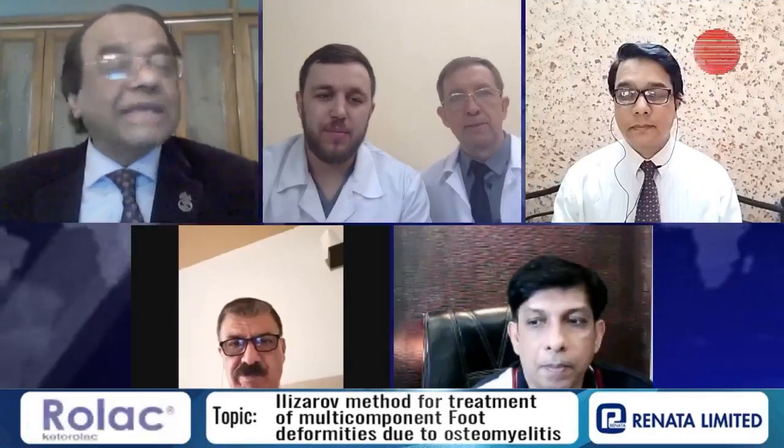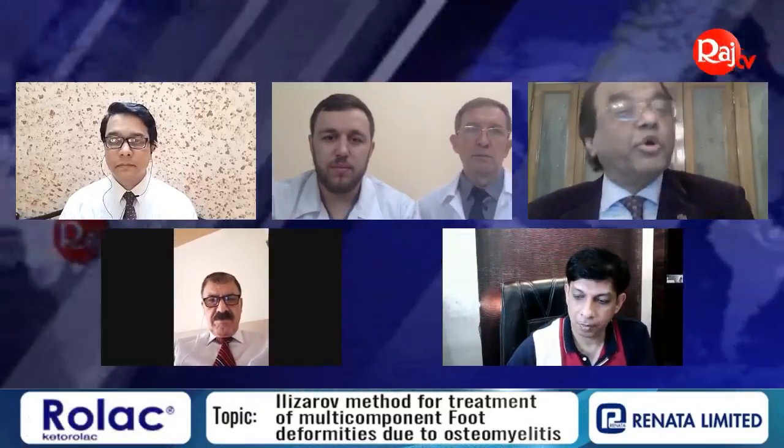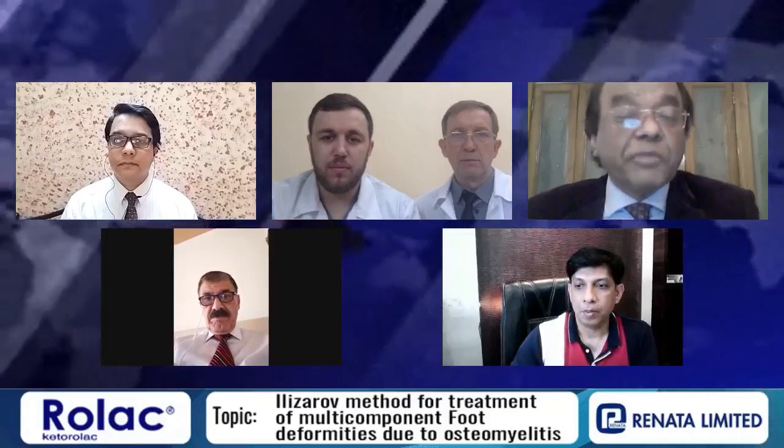Anatoly, I must say, these are fantastic cases that you have shown. Unique, excellent, because at this time I'm working on the same cases in 2 diabetic hospitals. There are a lot of cases; our population is very high. These are all purulent, necrotic cases in the foot, and really, without Ilizarov, nobody can treat. Exceptionally in foot cases, Ilizarov is still the best. In infected cases, you cannot put any kind of plate, screws, and other things in the foot. But following the principles and philosophy of Ilizarov, we can treat a lot of things.